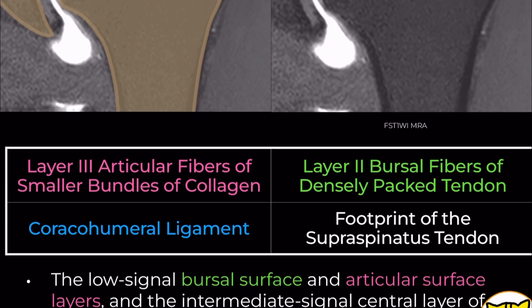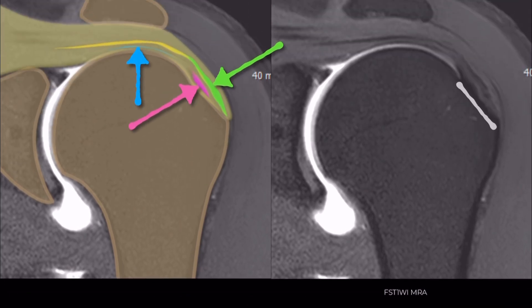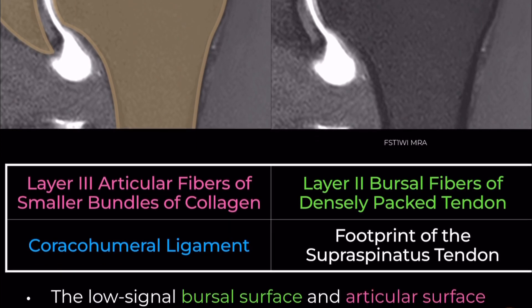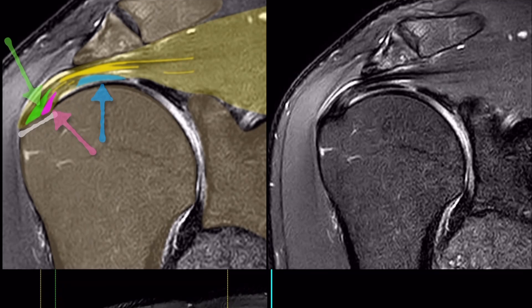Layer 3 — Deep Fibers: This is a thinner layer, approximately 3 mm, with fibers crossing at 45-degree angles and lacking uniform orientation. This layer also demonstrates low signal intensity, which can sometimes mimic the appearance of calcification in calcific tendonitis.